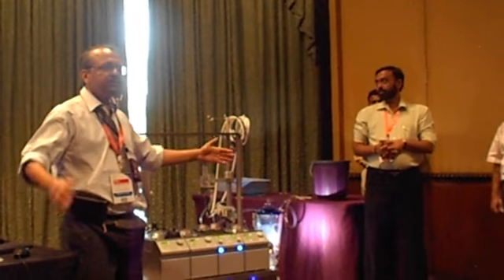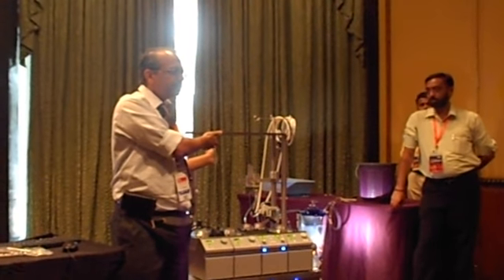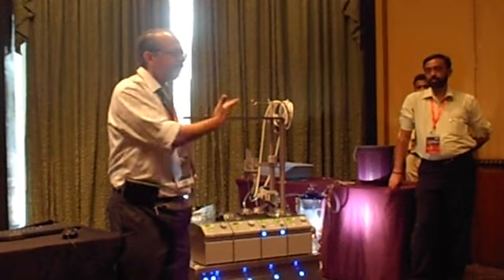Because venous and arterial are already clamped, now I need additional clamps near the membrane: the membrane inlet, gas inlet, outlet, all these recirculation clamps. All these four to five clamps are required. So remember, you need to provide him clamps. Very often in a small center, you may not have enough clamps, so you might have to give him the clamps you have kept.